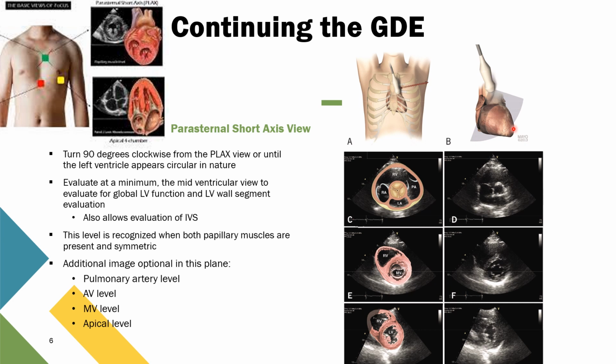If there's an area that's just being drug along, of course, that's going to be affecting the cardiac function overall, and you won't see that particular area thickening during those muscle contractions as much as the rest of the area around it.